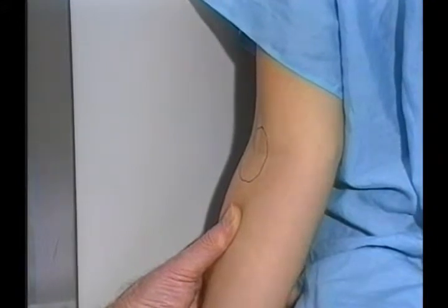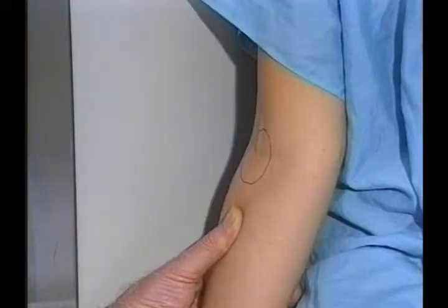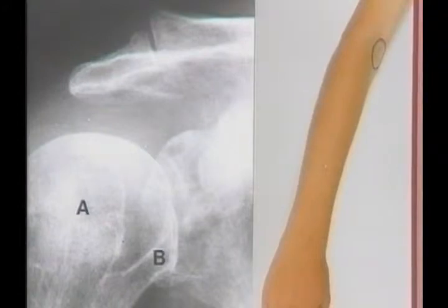If the elbow is rotated too much, the tuberosities become superimposed and hidden. On the contrary, if the elbow is in full internal rotation, the tuberosities are again superimposed in the axilla this time.